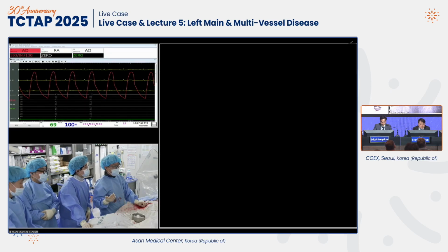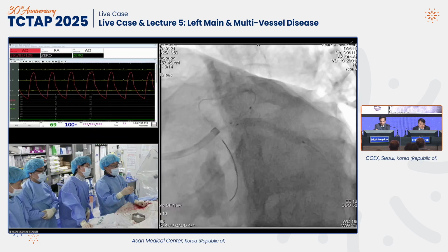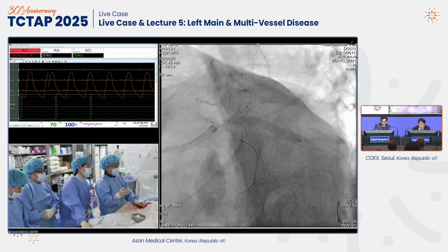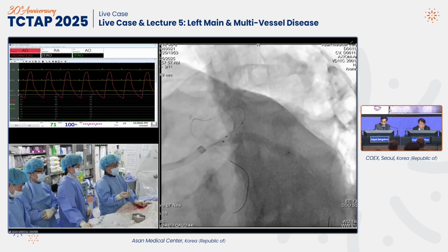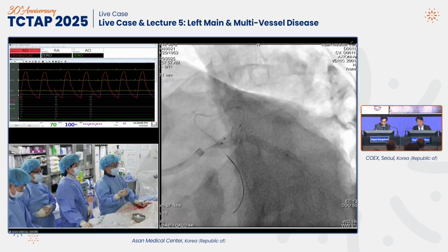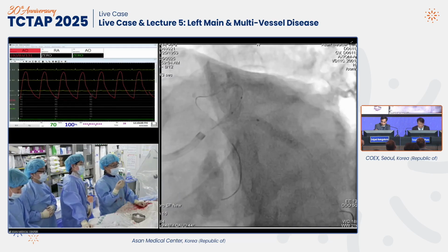Synergy stent, the 3.5 by 24, and the implantation, and the LAD balloon is 4.0 NC balloon. And the next one. So slightly pull back and the additional high pressure using the stent balloon. Next one. And this is a very sensitive step, people removing a wire.